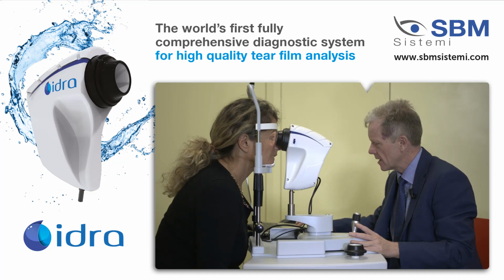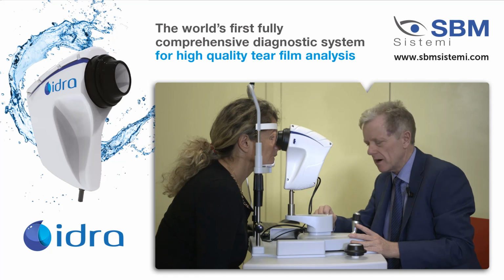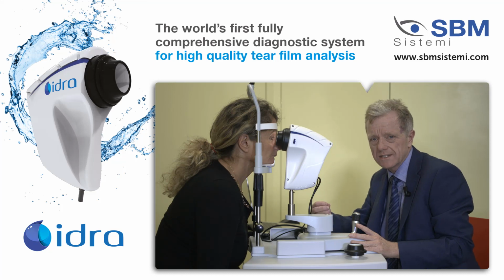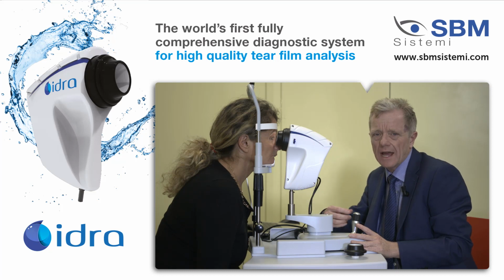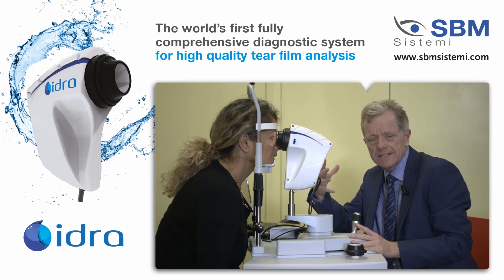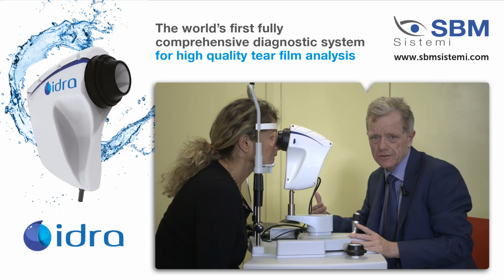We can also then take a little measurement along the lower lid, looking at the top of the tear meniscus, and then place another cursor on the eyelid margin, and that gives us the tear meniscus height, which is a valuation of the quantity of tears. The interferometry itself will actually look at the quality of the tears. So we have a measure in terms of how much tears there are, which would be an indication, if it was subnormal, of aqueous deficient dry eye. If we have a tear breakup time and the interferometry is abnormal, we would actually say the quality of tears is worse, and that may well drive an evaporative dry eye condition.